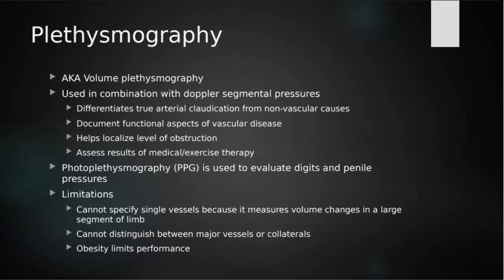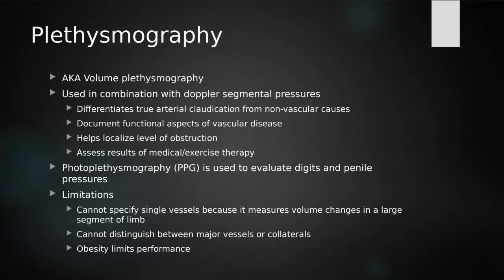Okay, next we have plethysmography. This is using the Doppler segmental pressures in combination with volume displacement.